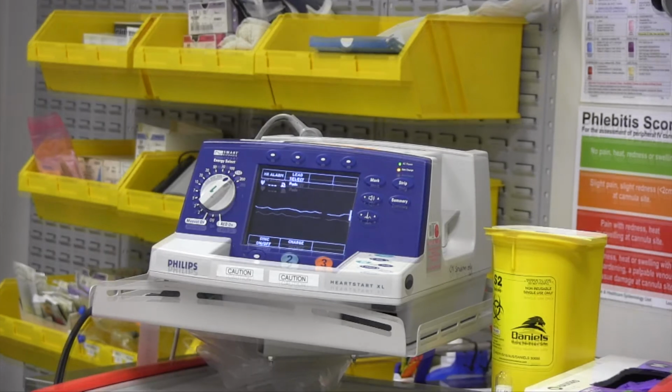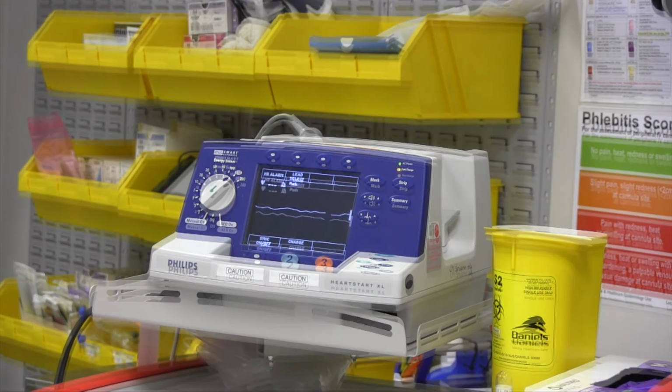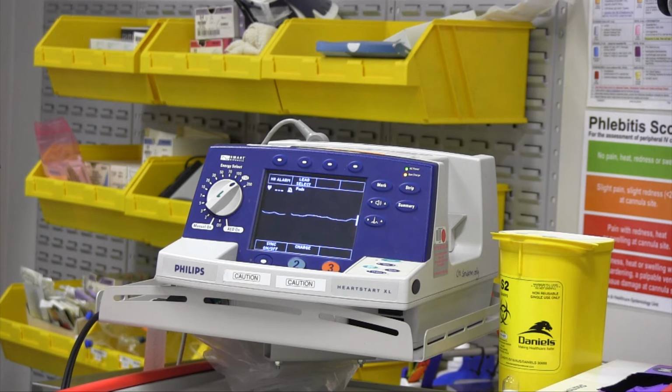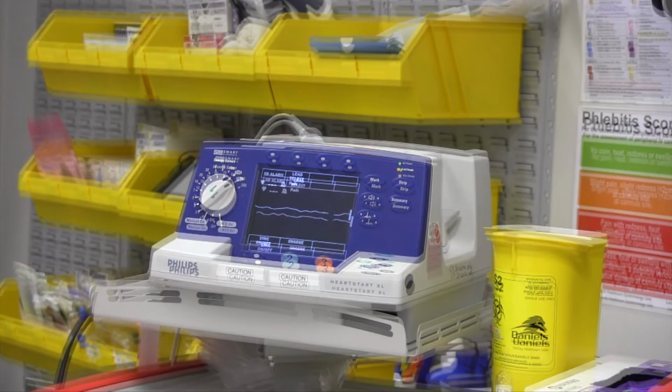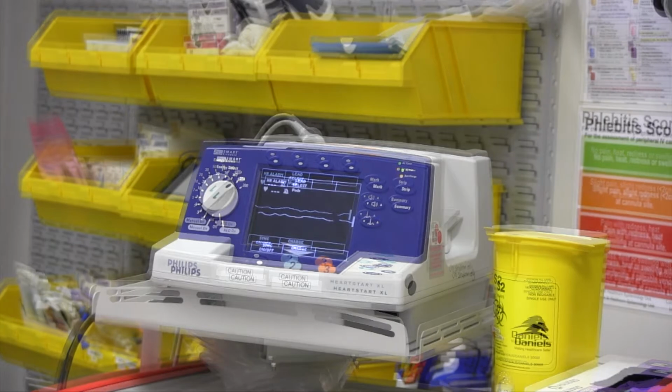Non-shockable rhythms include pulseless electrical activity, which is organised electrical activity without adequate cardiac output, and asystole, an absence of electrical activity. Monitoring must be checked and ECG gain optimised to confirm asystole.